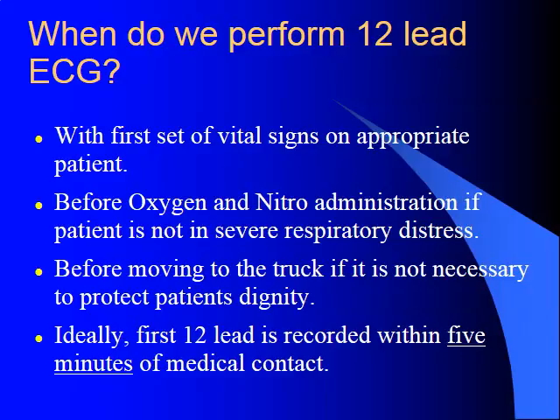We should try and get our first 12 lead tracing before we provide oxygen and nitro if the patient's not in severe respiratory distress. Obviously, airway, breathing, circulation comes first. We should do this before moving to the truck if it's not necessary to protect the patient's dignity, like we just discussed. Ideally, our first 12 leads should be recorded within 5 minutes of medical contact.